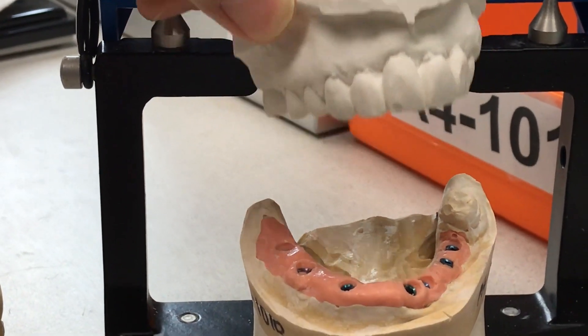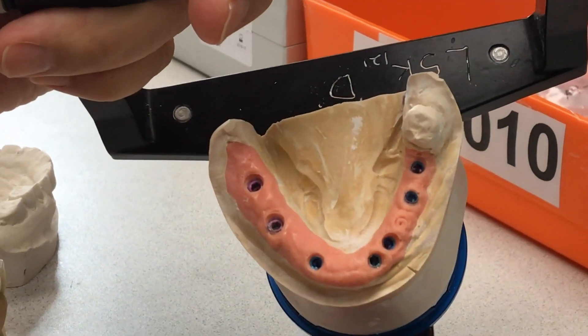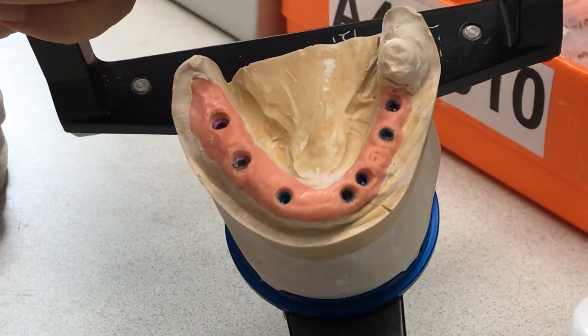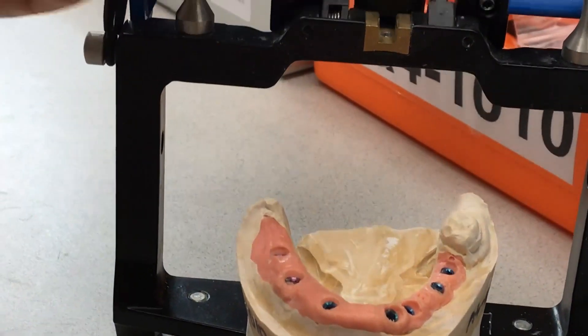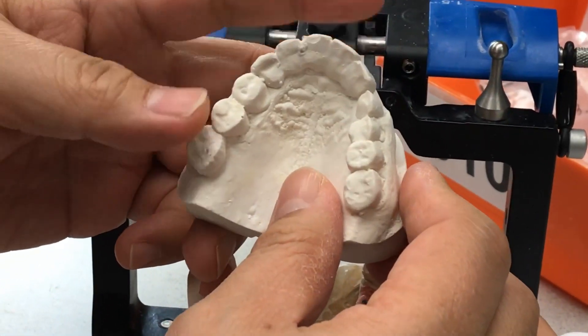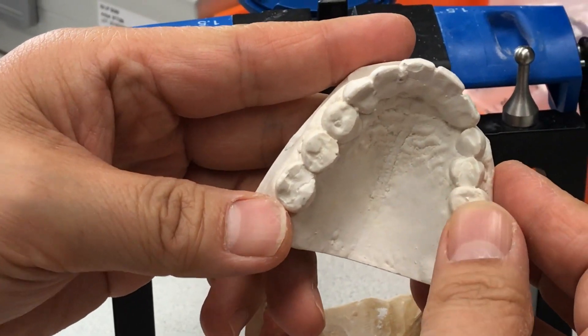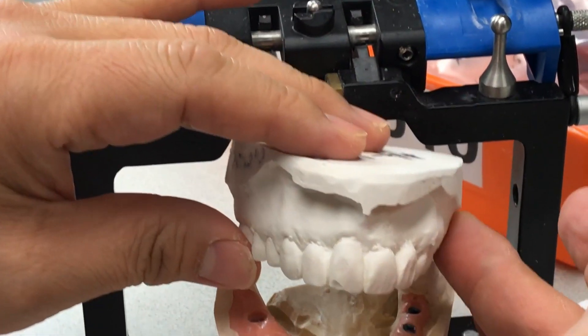There's another combo case with a seven implant lower, and the upper has the old five-unit bridge which is really sticking out facially, that we will correct in the top and bottom.